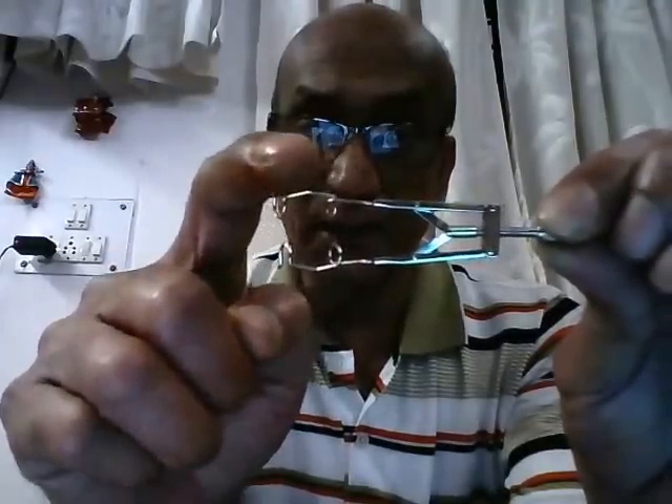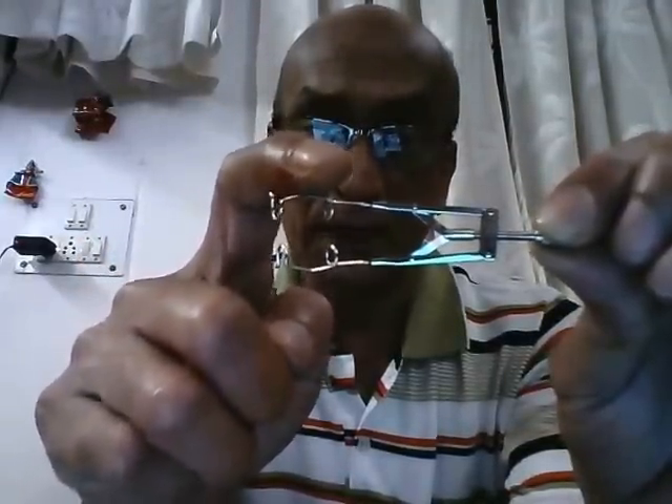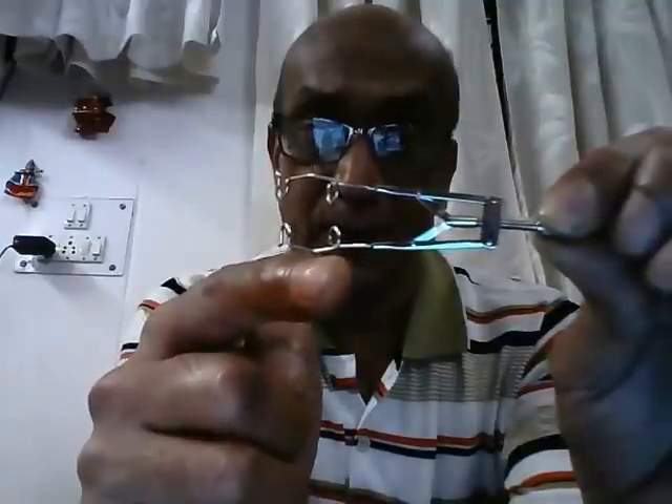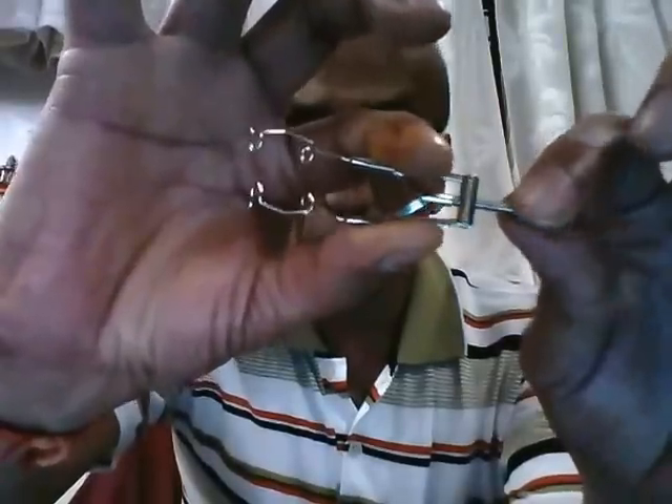The next instrument is used in ophthalmic surgery to separate the two eyelids. This is called a universal eye speculum. One limb is inserted under the upper eyelid and the other under the lower eyelid. Once inserted, we turn the screw handle to open it up. That is why this is also referred to as the adjustable eye speculum.